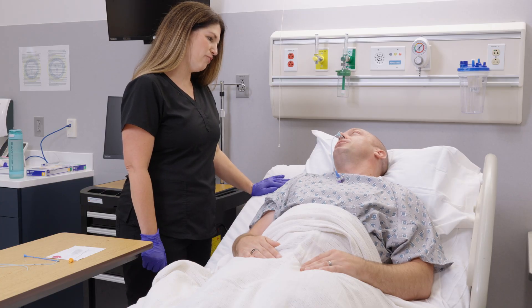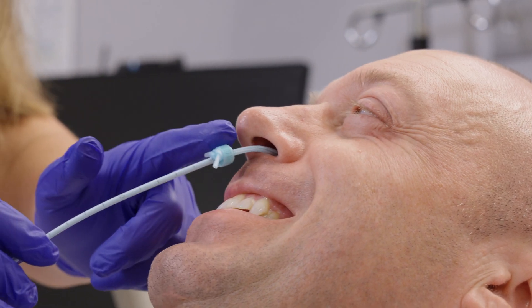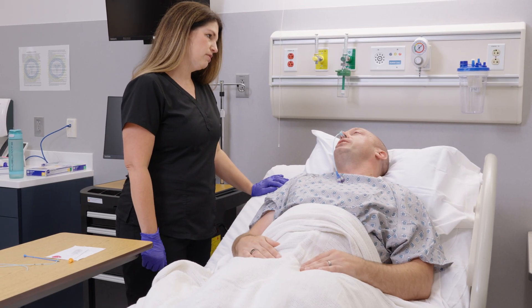You may now begin to clean the bridal probe. Using warm soap and water or a wipe, clean the clip, tubing, and the site, ensuring it is free from any mucus, formula, or medication residue.